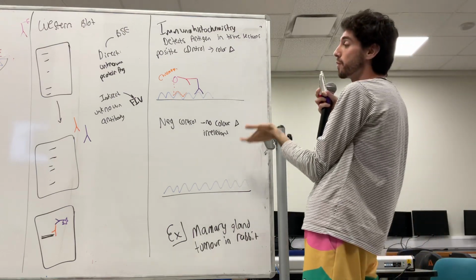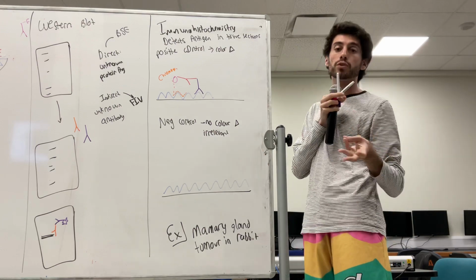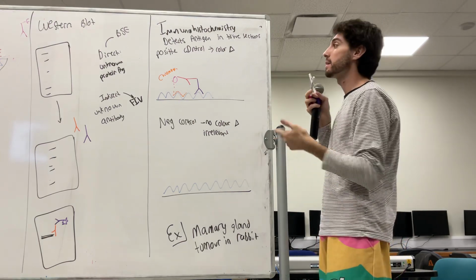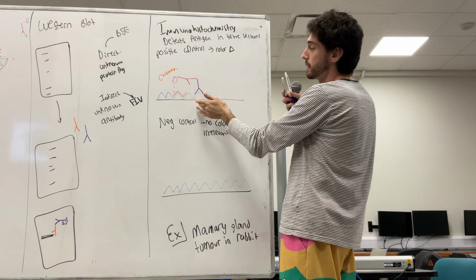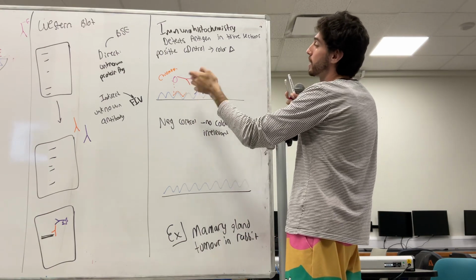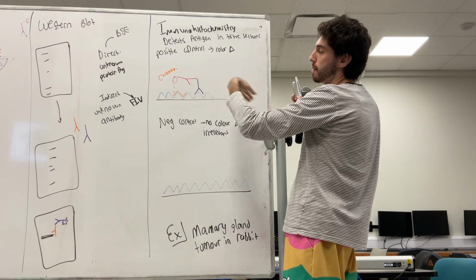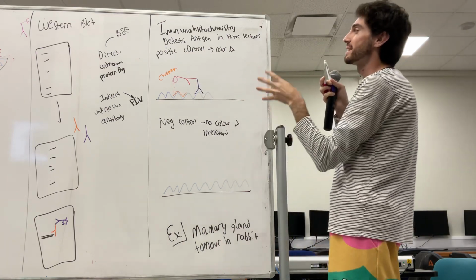Basically, when we're running these, we have a positive and a negative control, and there's some horseradish in it, which, if it's positive, will turn brown. We know that it's positive because of that horseradish. And so we have these unknown antigens, and then we're going to come along with our patient serum, we're going to run, sorry, I messed that up, so take that back.